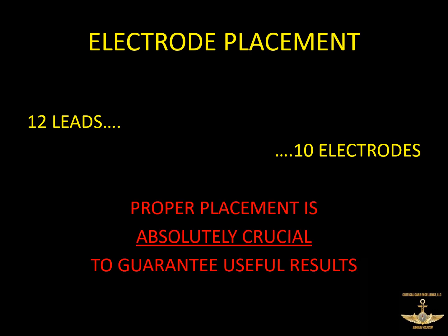To do a 12-lead EKG, to get 12 leads, that takes 10 electrodes. And where you put every single one of those is absolutely crucial to get useful results. This is going to vary a lot depending on the facility you go to work in or do your clinicals in. This is going to vary a lot depending on what you read. But the science is pretty clear on where these things need to go.